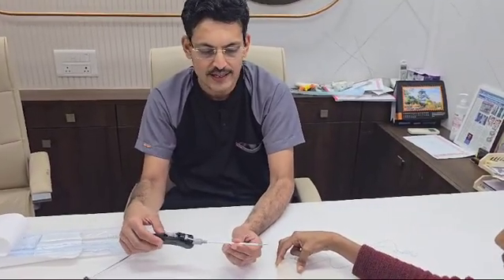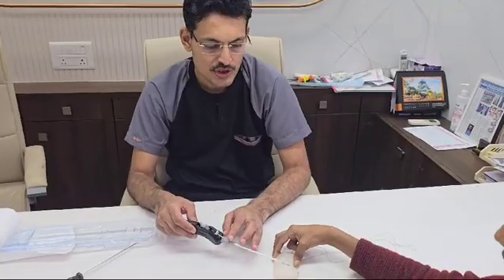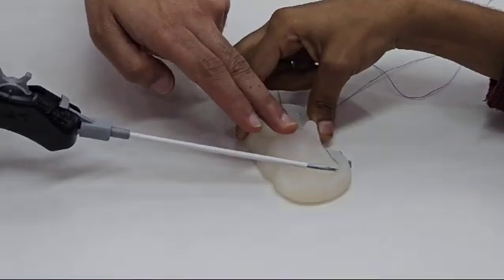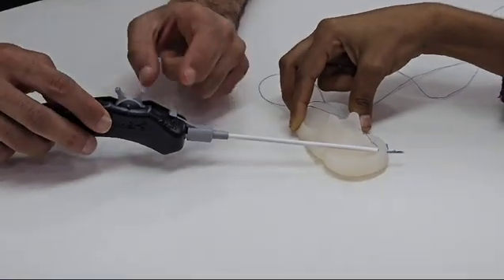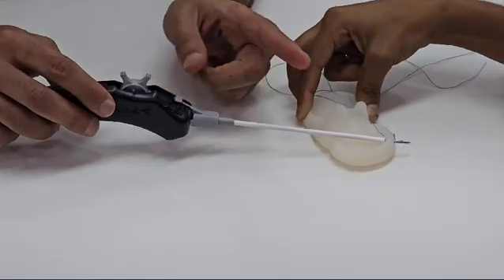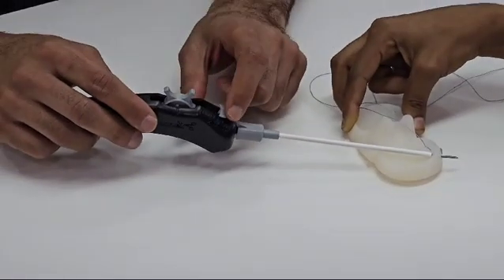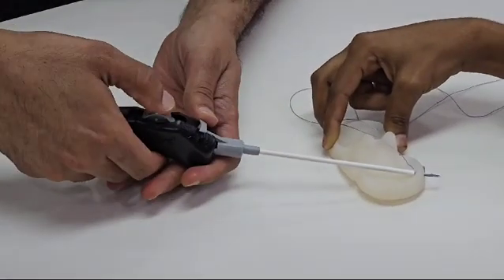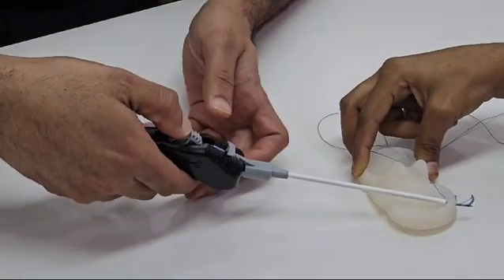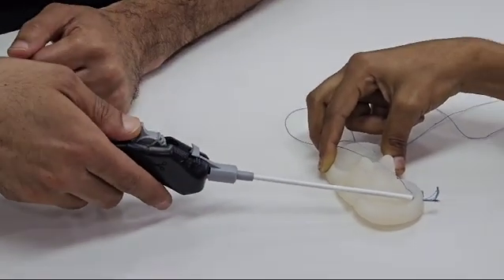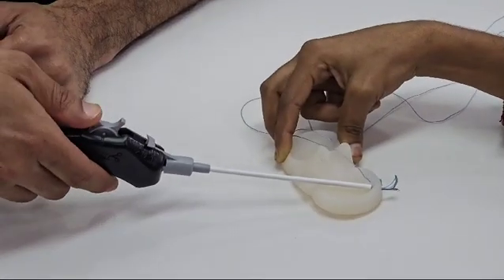Now about the technical aspect - it's pretty simple. You just have to focus the area where you need to deploy it. You push it in, the device is gone in. We have already adjusted the depth spot, and then we have to press the trigger back. This will fire the implant in, and then we have to take it back like this.